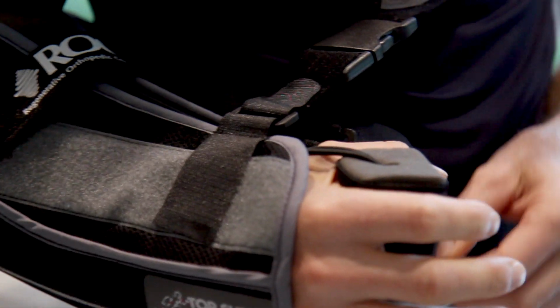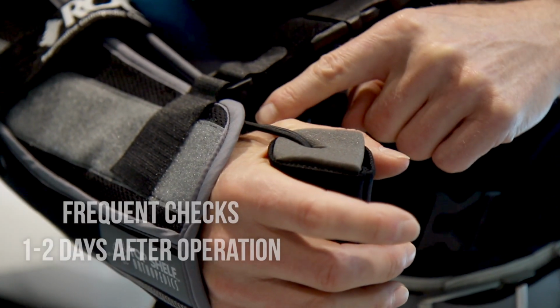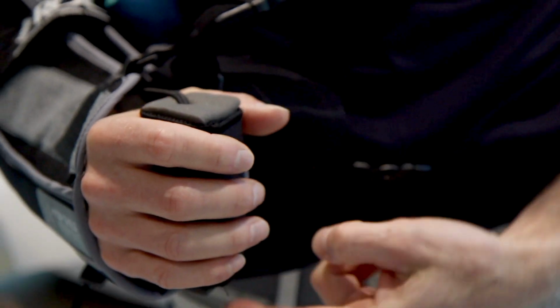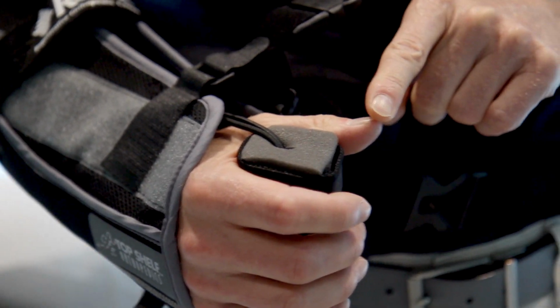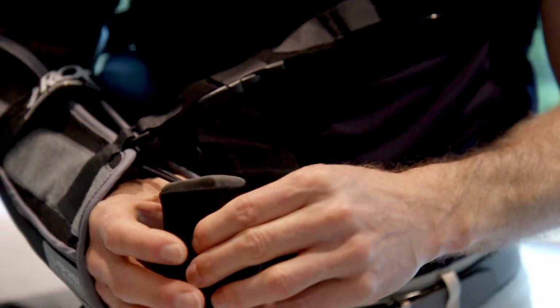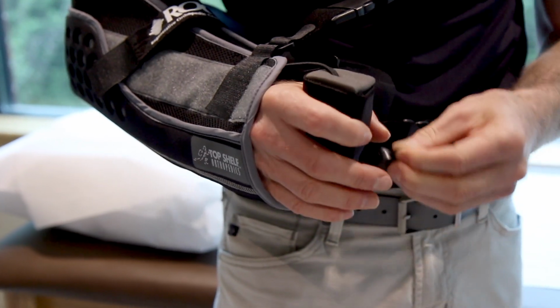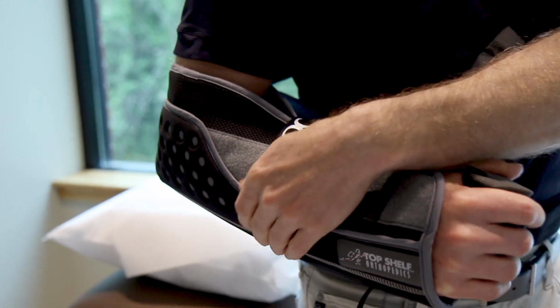I do like patients to pay particular attention that the straps here and down here are not cutting too hard onto your skin. So particularly the first day or two after your surgery, frequently check and make sure that these straps are not cutting too hard against the skin. We would not want that to cut the circulation off to the finger or the thumb. And this can be adjusted with a simple tensioning device right here. Okay, so that would make it relaxed such that that could be pulled away, and then that could be tightened like such. This strap here just serves to kind of keep the arm tucked in.